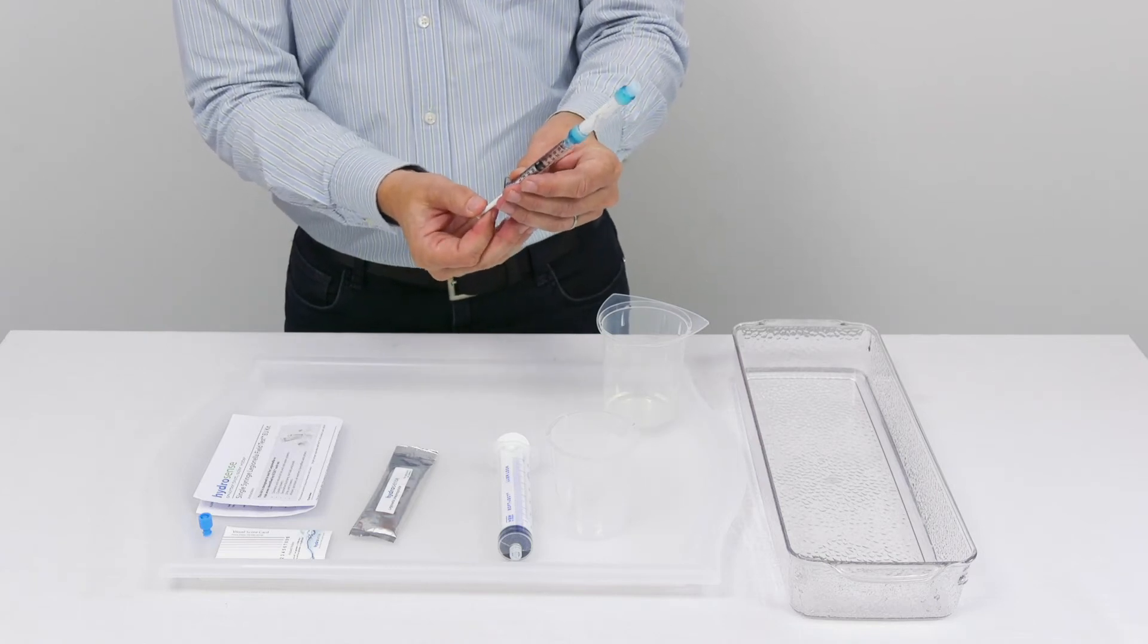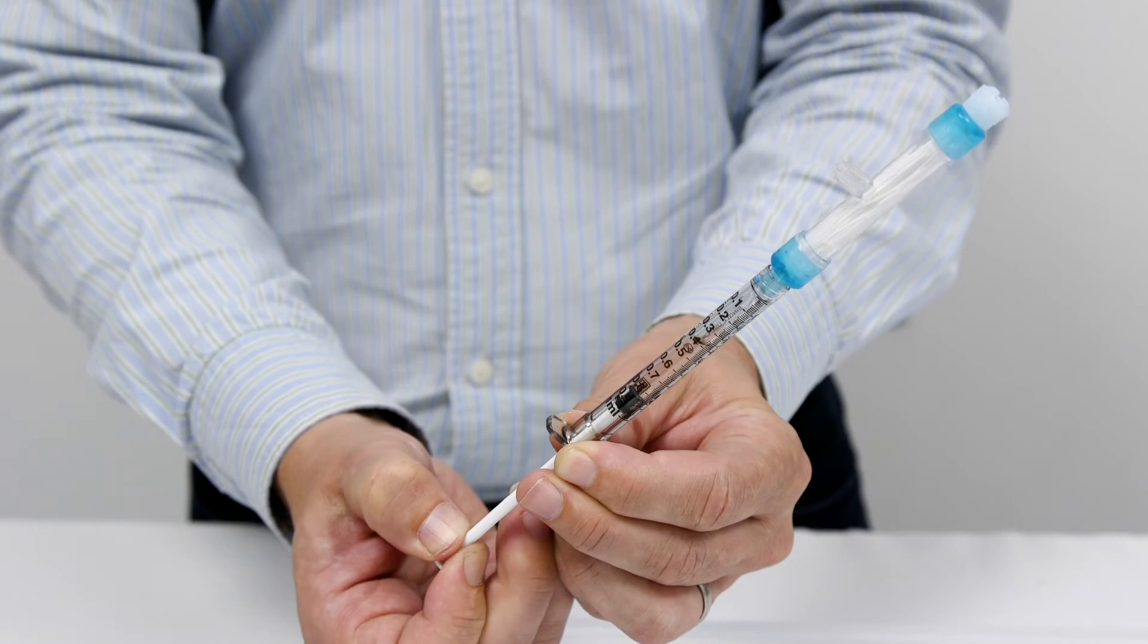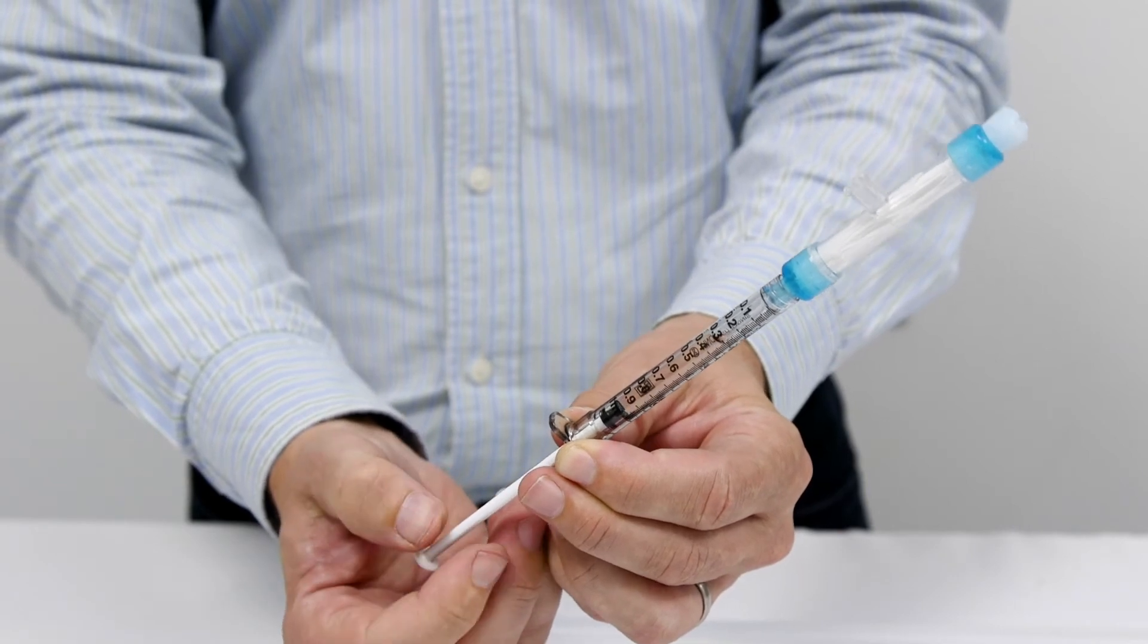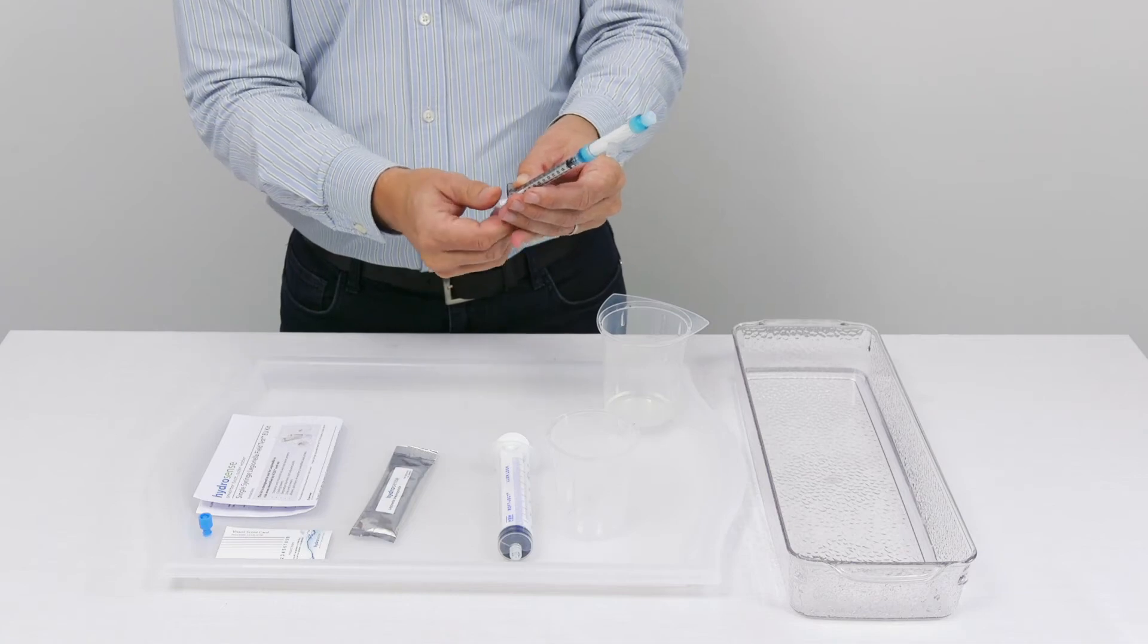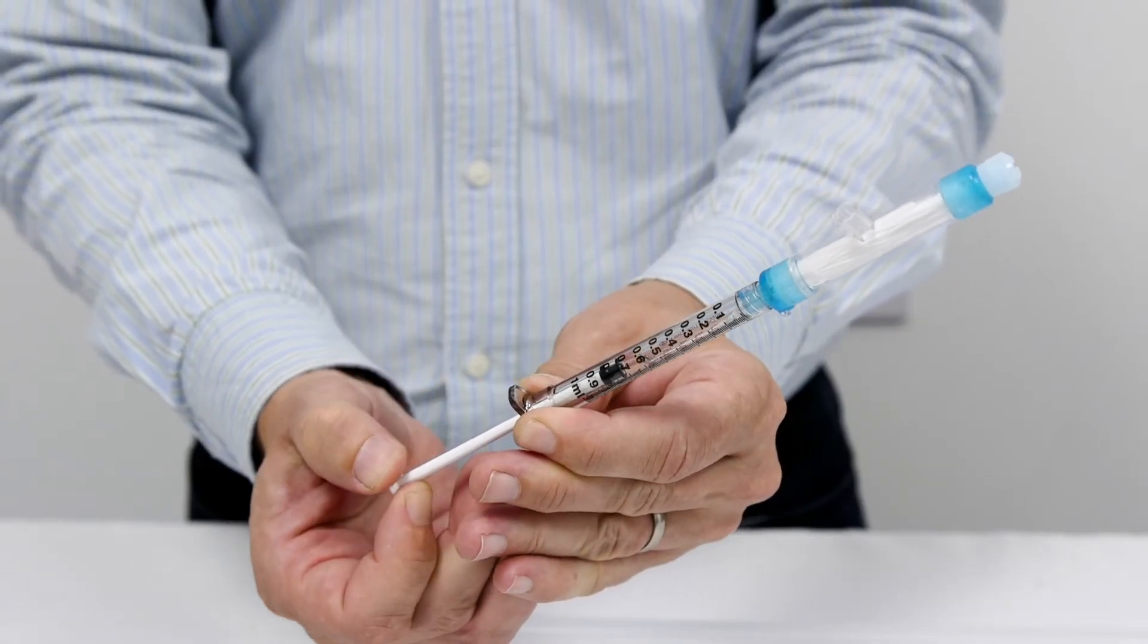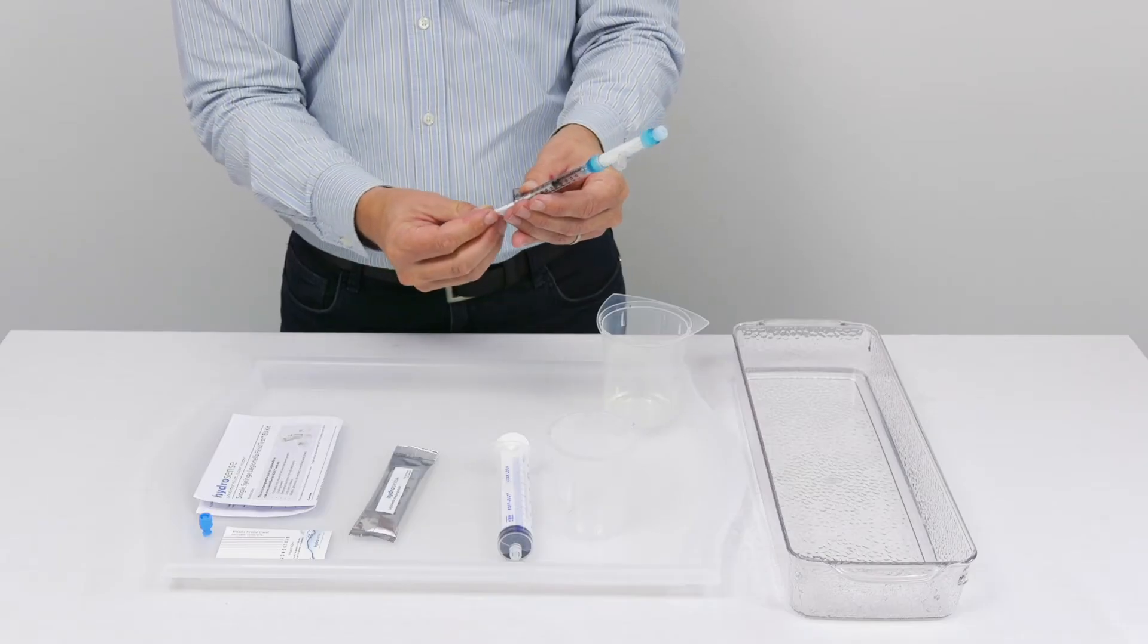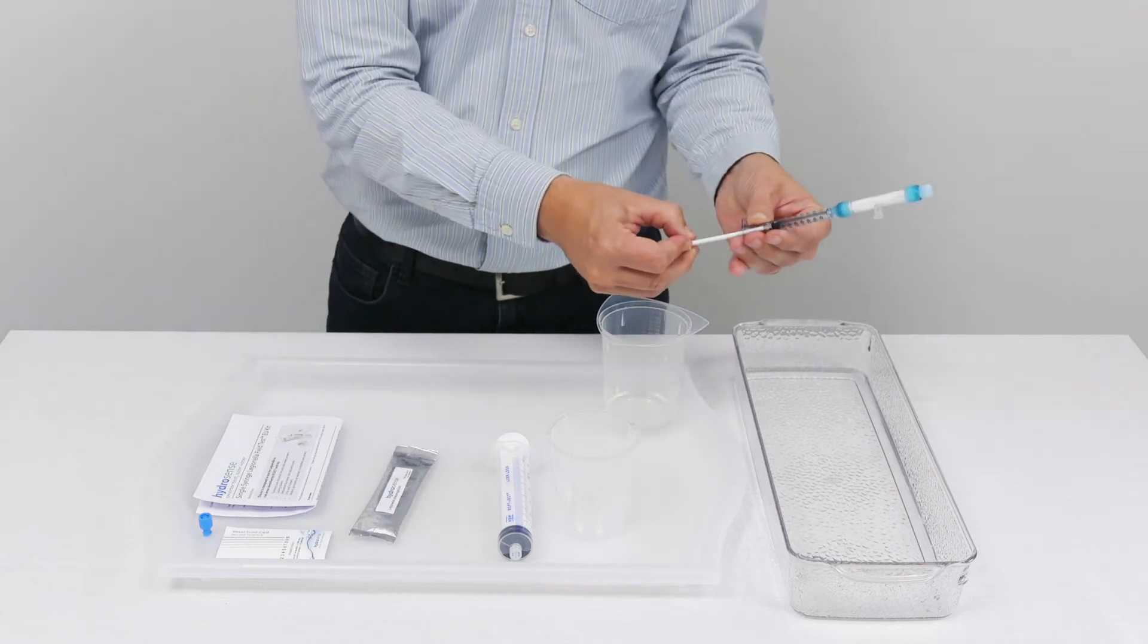The first step is to pull the plunger back to the one milliliter mark on the syringe right at the bottom and then push it into the sample. We then pull back to the one milliliter mark and then push in, and repeat this three times.